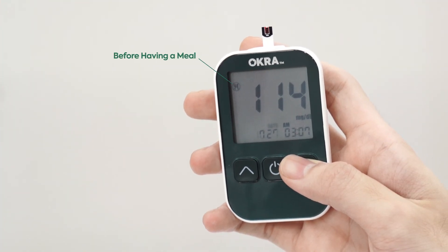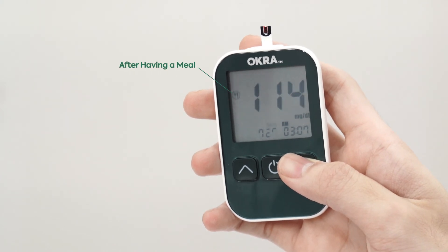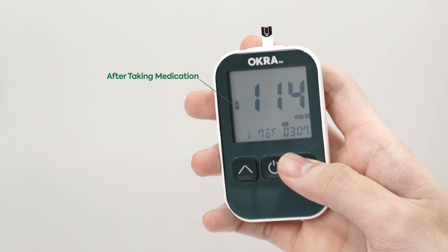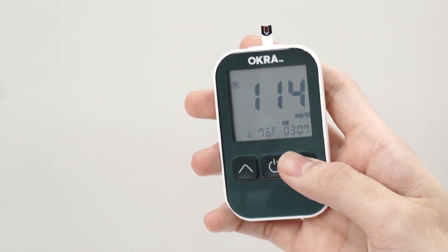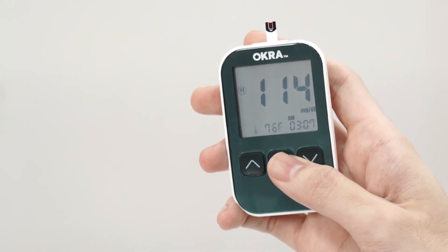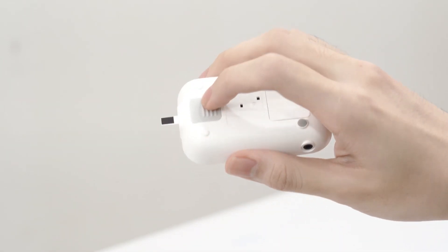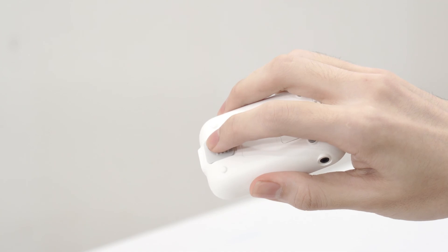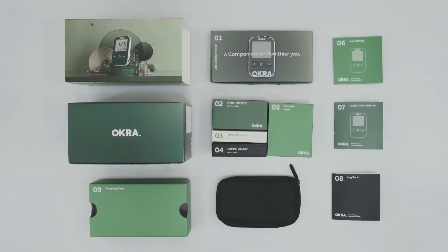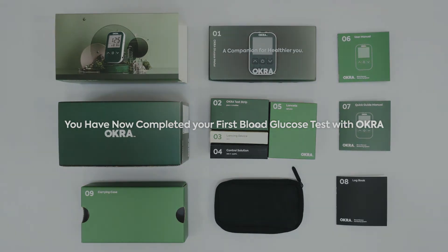If you have turned on the activity option, you can select the activity or meal by pressing the up and down buttons. Press the power button to save your condition for the test results. Push the test strip ejector on the back of the meter to remove your used test strip. Press the power button to turn off your meter. You have now completed your first blood glucose test.